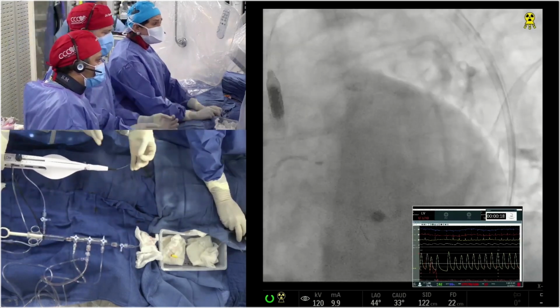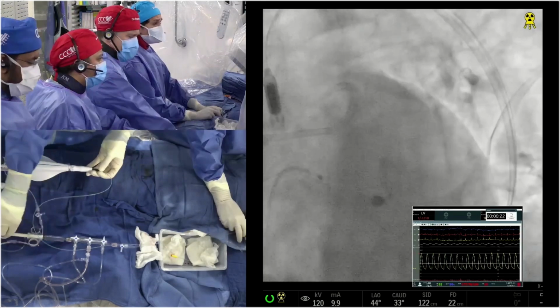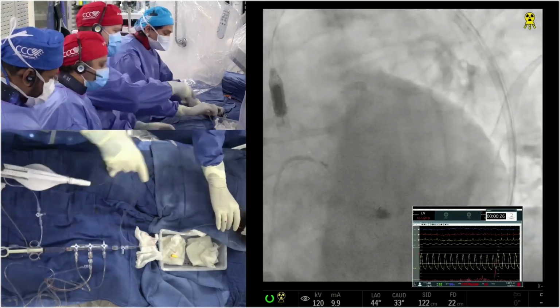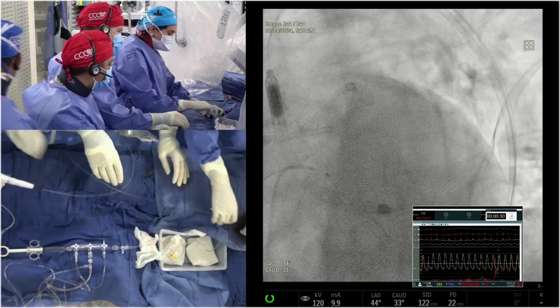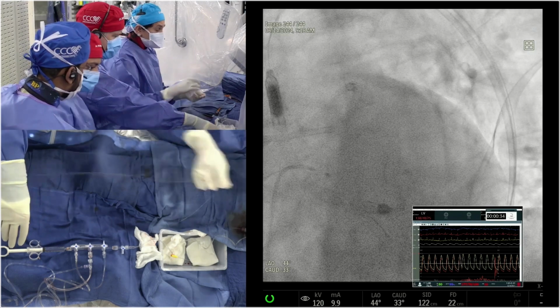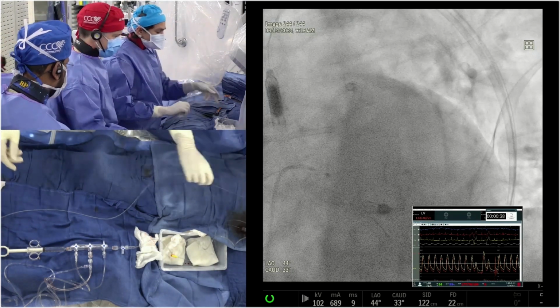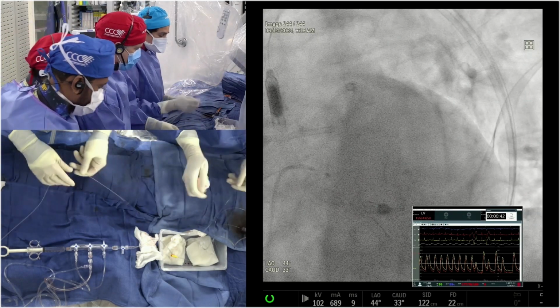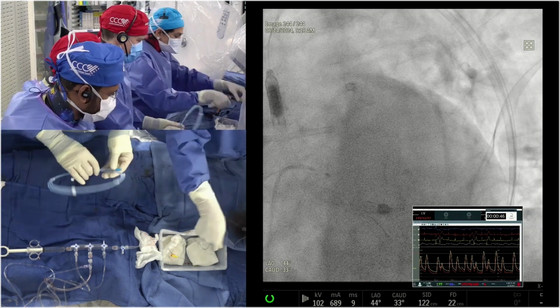So if you see that, how do you pick the burr size based on imaging? It's a short lesion, and the diameter at that level where the eccentric calcium is, is like 1.7 we are getting. So we picked a 2.0, so we know some kind of atherectomy can happen. That's why it is not, I would say, a jump. It's a short lesion at that angle, probably. That's why the 2.0 burr atherectomy was happening with the 2.0 burr. That is why we see that.